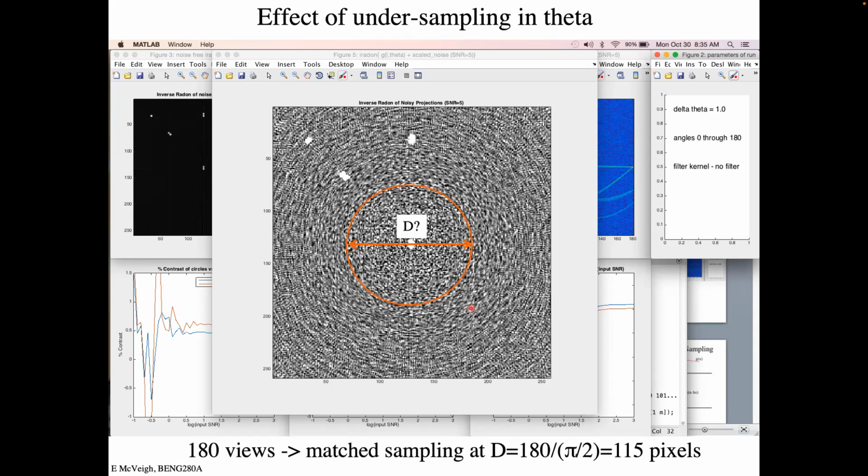It turns out that along this arc, we want to have an estimate at each point as we're rotating our sampling comb. And if I have an arc way out here, many more sample points are required to get a sample point per millimeter.